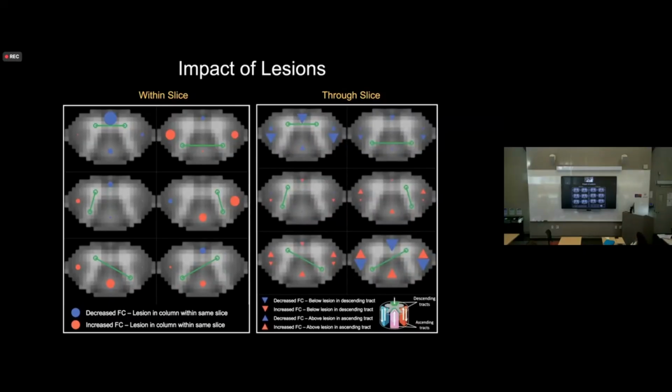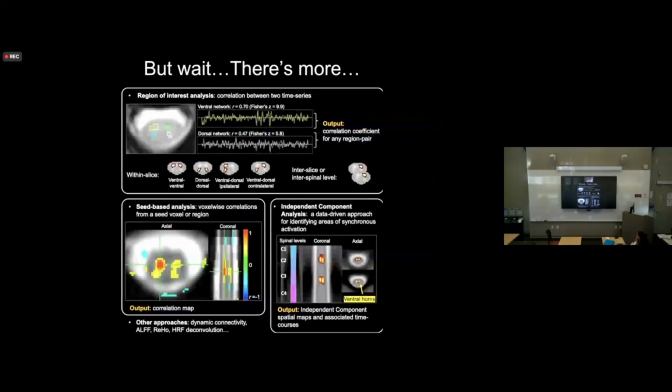So the short of it is that while we can look at functional connectivity between horns, when there's a change in the tissue health, the white matter health, the gray matter health, lesions that don't spare the gray matter boundary, then what we find is that our functional connectivity between healthy controls and MS patients can go up, it can go down, and we're also fighting the question about noise and whether or not these are measures that are reliable. And I think we've established, and the community has established, that these are reliable, but it's influenced heavily by the multitude of lesions that show up in the cord.